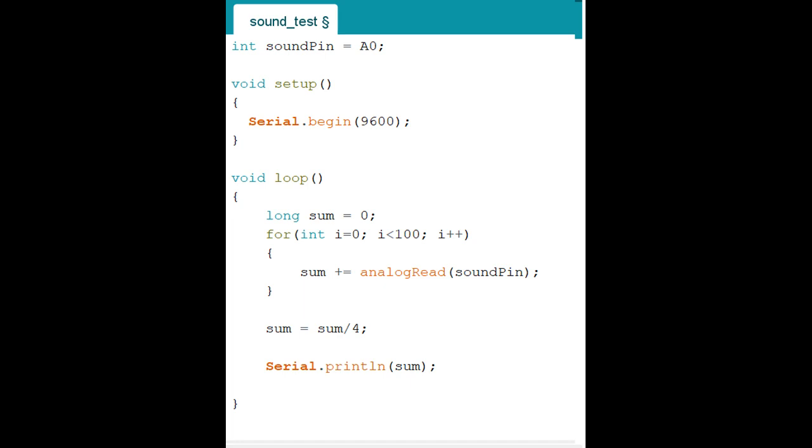So integer space, so what it says is like, oh, this is an integer. I'm telling the computer through the software, Arduino software, this is integer. What is integer? Sound pin is integer. I just named it sound pin. Okay, so why I call it pin? Because Arduino, the hardware that I explained to you in this different video, there's a pin, right? So there is two different kind of pin. If you remember, there's an analog pin and then digital pin. So I'm going to assign the pin, I'm gonna call it sound pin, which is equal to A0.